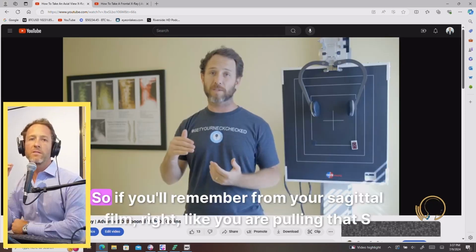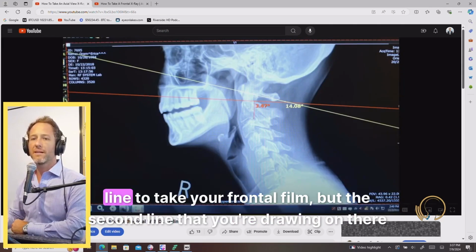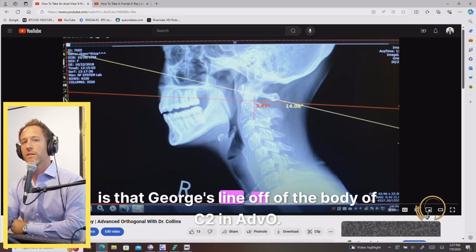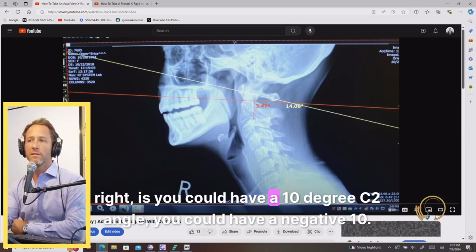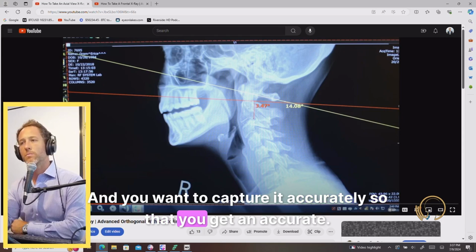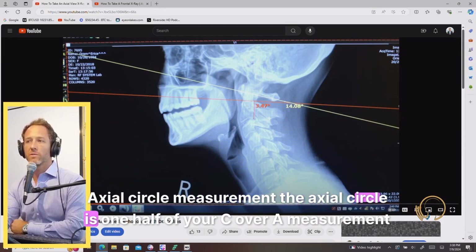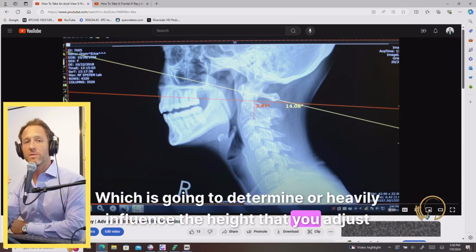Hopefully not. So if you'll remember from your sagittal film, you are pulling that S line to take your frontal film, but the second line that you're drawing on there is that George's line off of the body of C2 in AdvO. And the reason we're doing this and not just dropping an arbitrary line at 0 is you could have a 10 degree C2 angle, you could have a -10. You want to capture it accurately so that you get an accurate axial circle measurement. The axial circle is 1/2 of your C/A measurement, which is going to determine or heavily influence the height that you adjust somebody at.